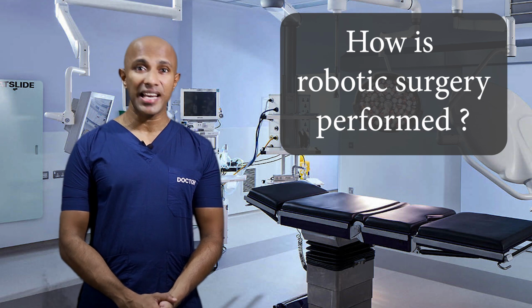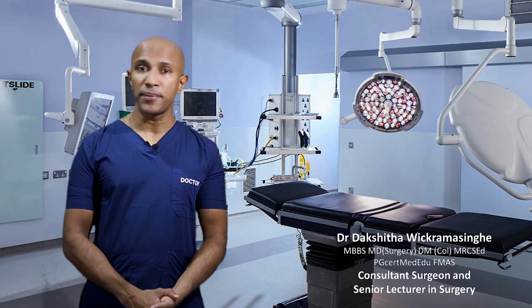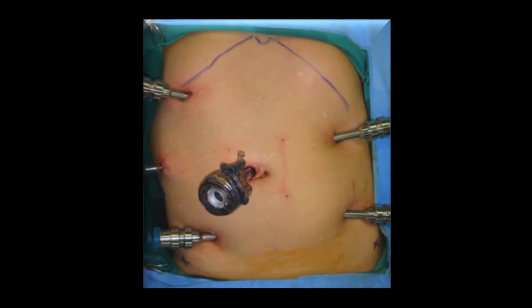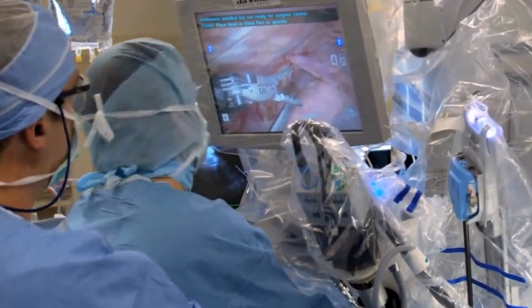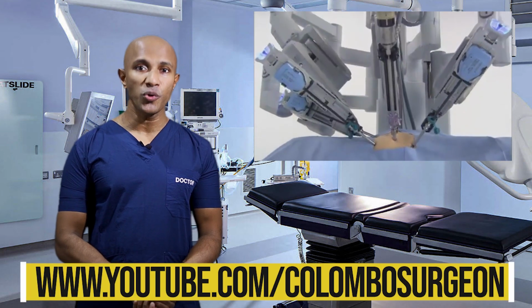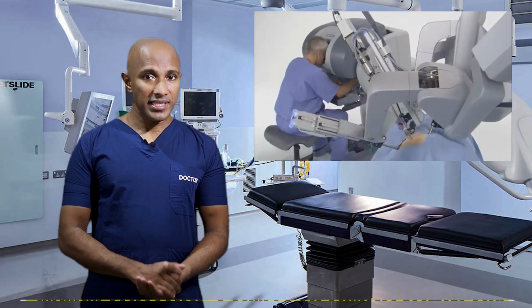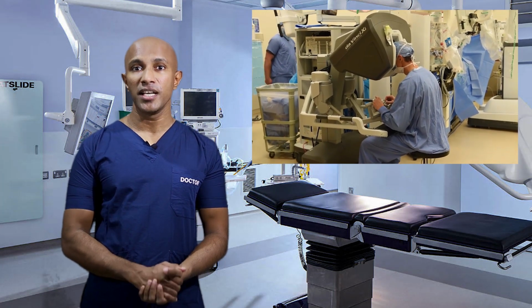The actual surgery that happens inside your body is very similar to what would happen during open and laparoscopic surgery. What is different are a few steps before the procedure starts. Just like laparoscopic surgery, your surgeon will make a few cuts in your belly to insert ports. These are tubes which allow the instruments of the robot to go inside your tummy. Through one of these ports, the robot also inserts the camera. This camera provides the view that is necessary for the surgeon to see what's wrong and to conduct the surgery.